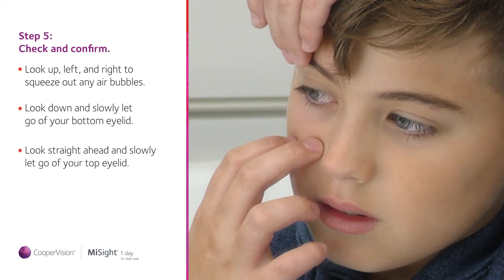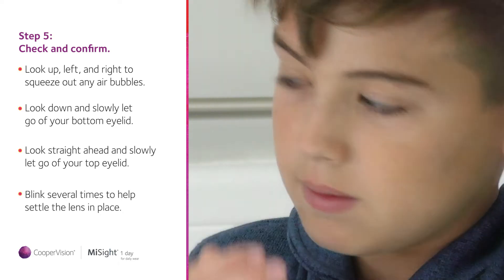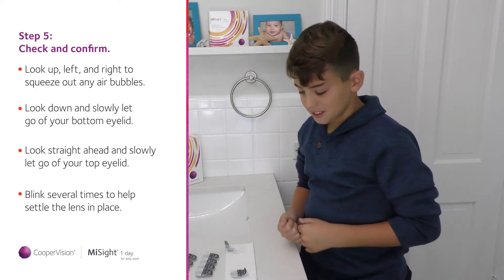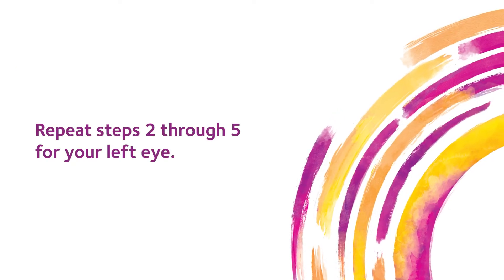Look straight ahead and slowly let go of your top eyelid. Slowly and gently let go of your eyelids so that they don't squeeze the lens out before it has a chance to settle. Now blink several times to help settle the lens in place and repeat these steps for your left eye.